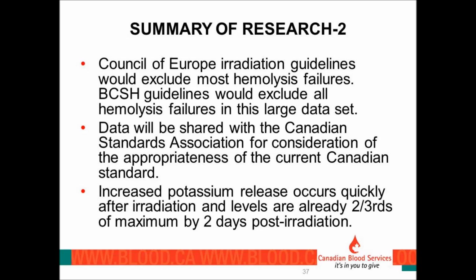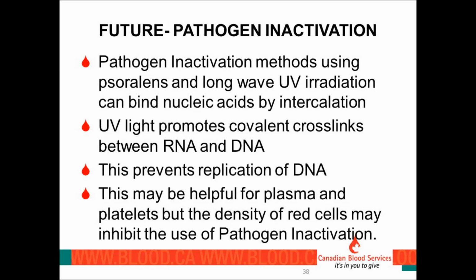And what's been done is this data is being shared with the Canadian Standards Association that sets the CSA standards for what we do in Canada. And the CSTM standards are also based on the CSA standards, and we'll look at setting stricter guidelines and standards in Canada. And increased potassium release occurs quickly after irradiation, and levels are already 2/3 of the maximum by 2 days post-irradiation. In the future, what we're looking for is pathogen inactivation.